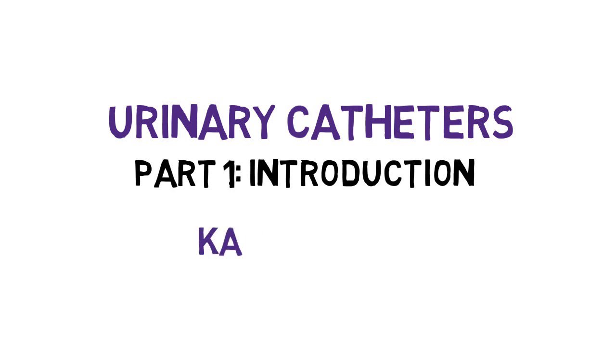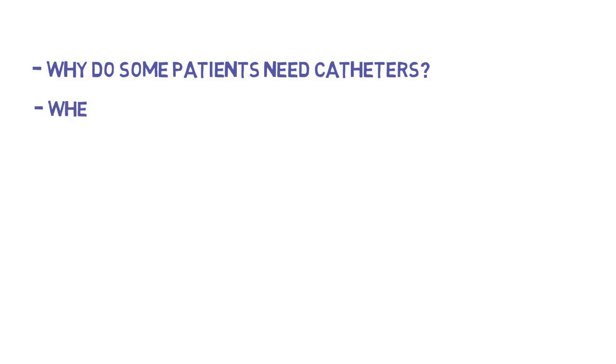Urinary catheters. Everything one needs to know. Part 1, Introduction. Today we're going to discuss why some patients require a urinary catheter, whereabouts these catheters can be placed along the GU tract.